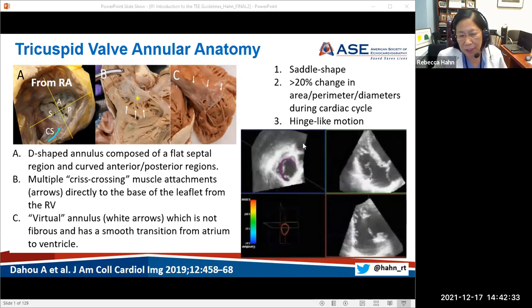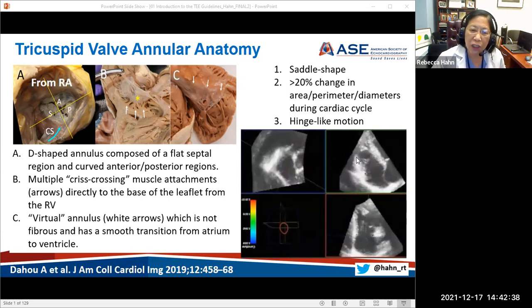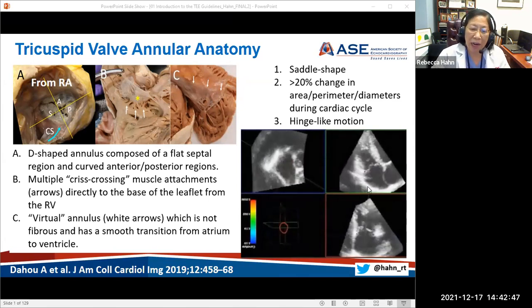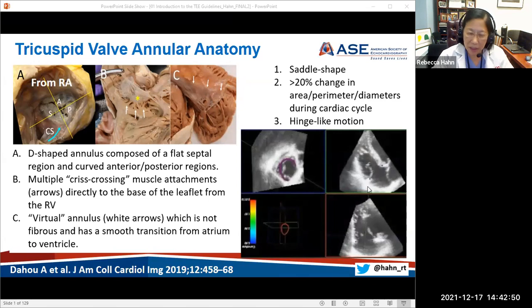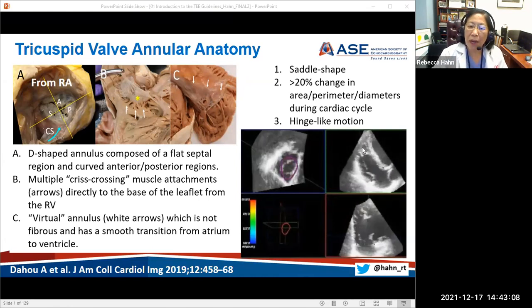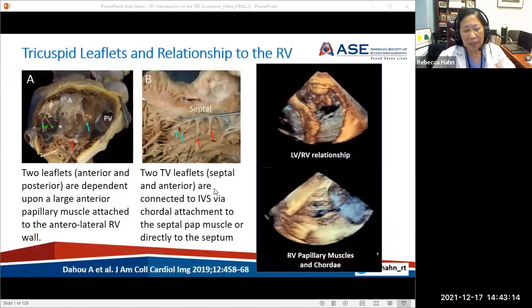This is not like the mitral side at all. Because it's tethered by the septum, you can see that it's mainly hinging on the lateral side. This is what we're going to measure as the TAPSE, tricuspid annular plane systolic excursion, but it is also the main driver for RV function early on, or in a normal patient. And so because of this beautiful longitudinal shortening, you now are able to really almost passively transfer blood directly from the right atrium into the right ventricle, thereby increasing the efficiency of blood flow across the right heart.